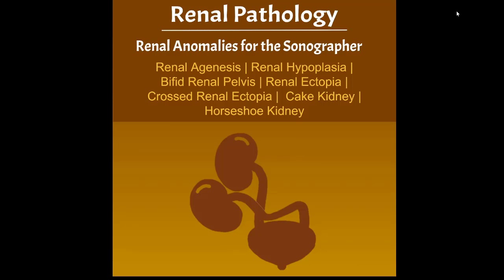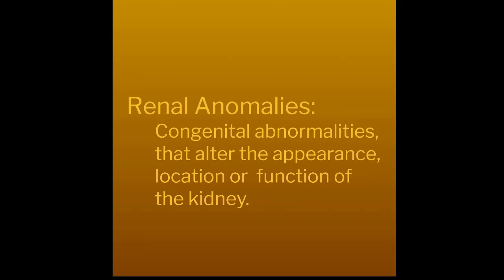Welcome to our sonography lecture on renal pathology, part 1 of 14, renal anomalies for the sonographer. This lecture will cover renal agenesis, renal hypoplasia, bifid renal pelvis, renal ectopia, crossed renal ectopia, cake kidney, and horseshoe kidney.